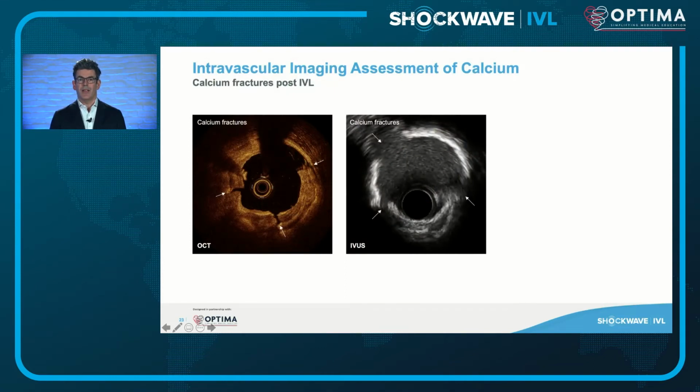So intravascular imaging shows the mechanism of action. It also shows you where you should be targeting your shockwave energy. And whether it's with OCT or intravascular ultrasound, you can see evidence of calcium fractures.